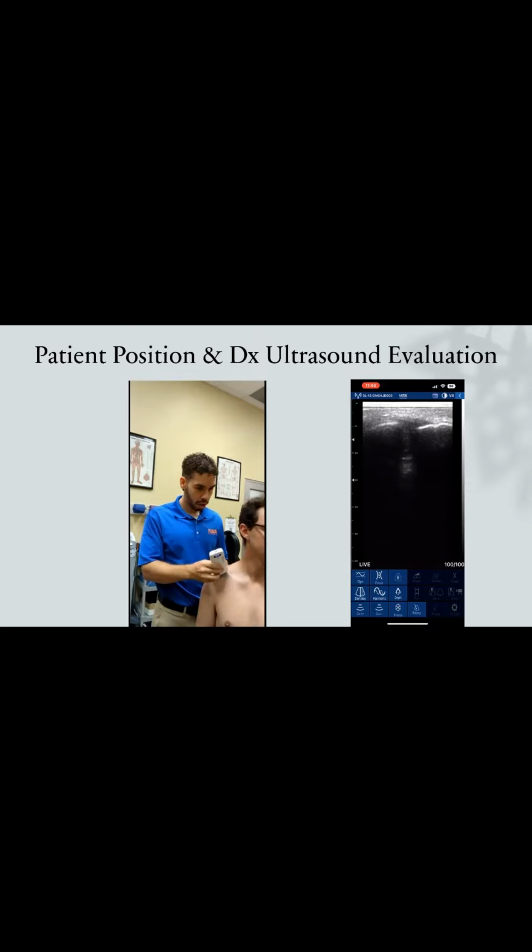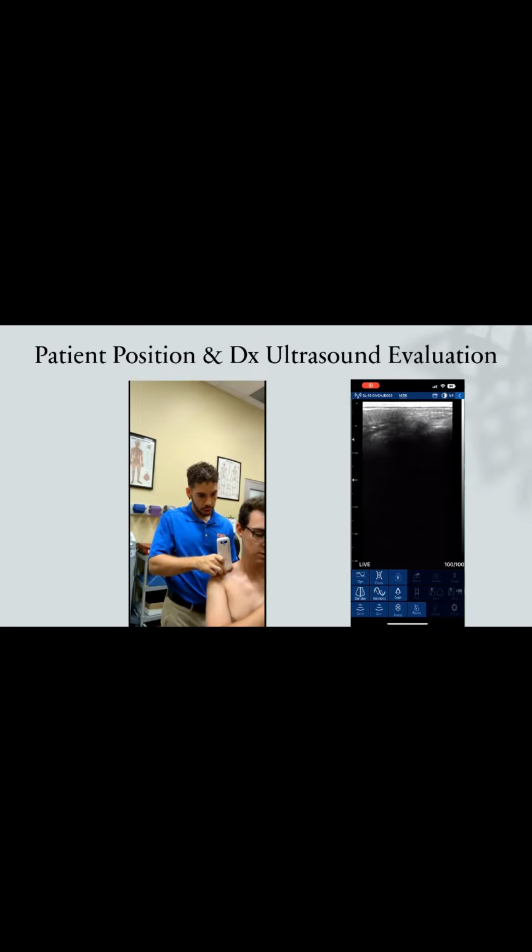The cross-shoulder adduction test, also known as the scarf test, will be used to assess the AC joint. The clinician will want to observe for any asymmetric widening, narrowing, or offset, which can imply some instability of the AC joint.